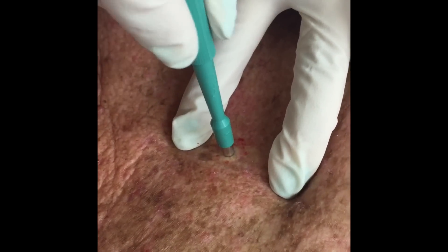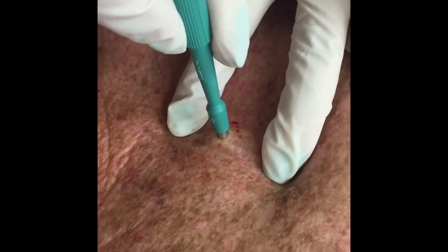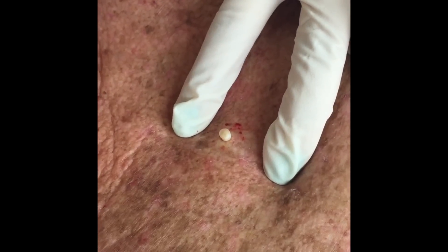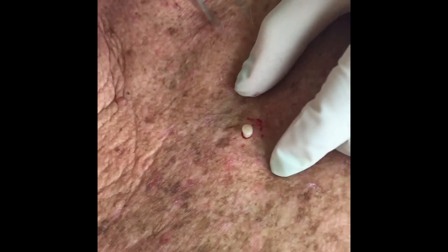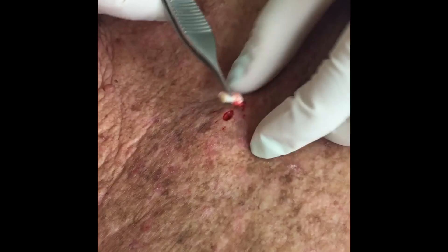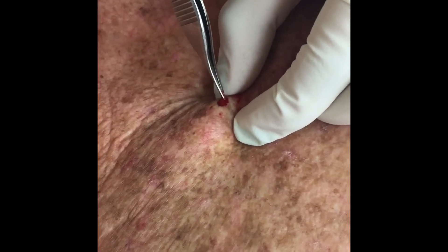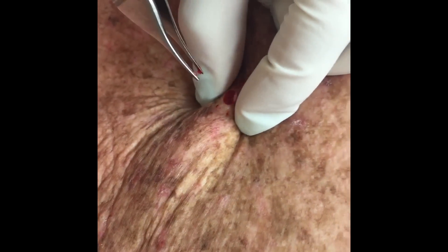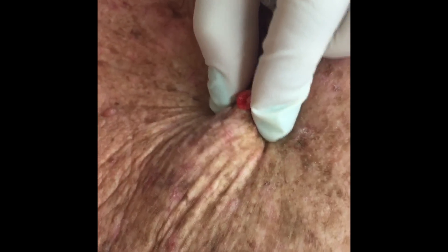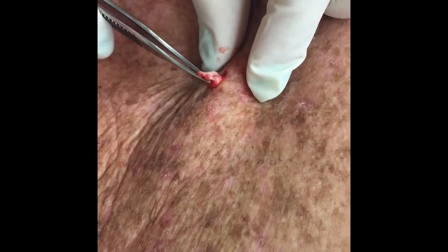We're doing a punch excision — like a little cookie cutter that squeezes it out. The little cyst is in here, the little cyst contents right there. We want to try to get the whole sack out, and it comes out nice and smoothly.